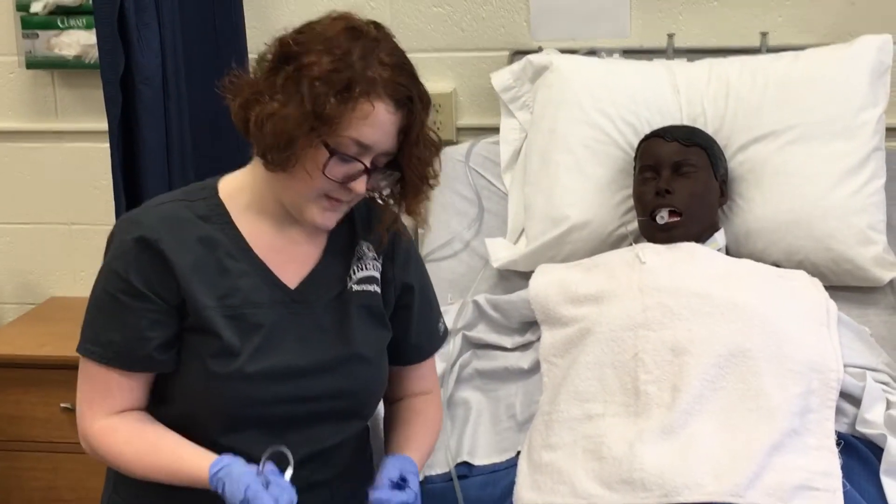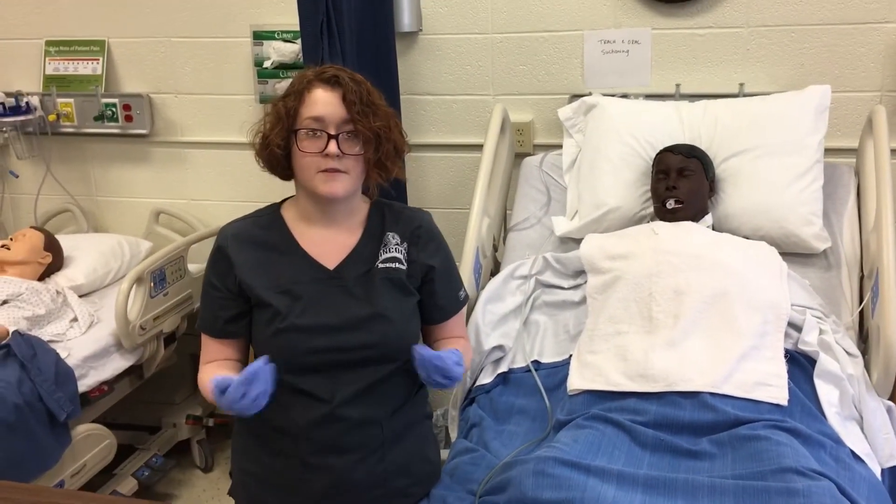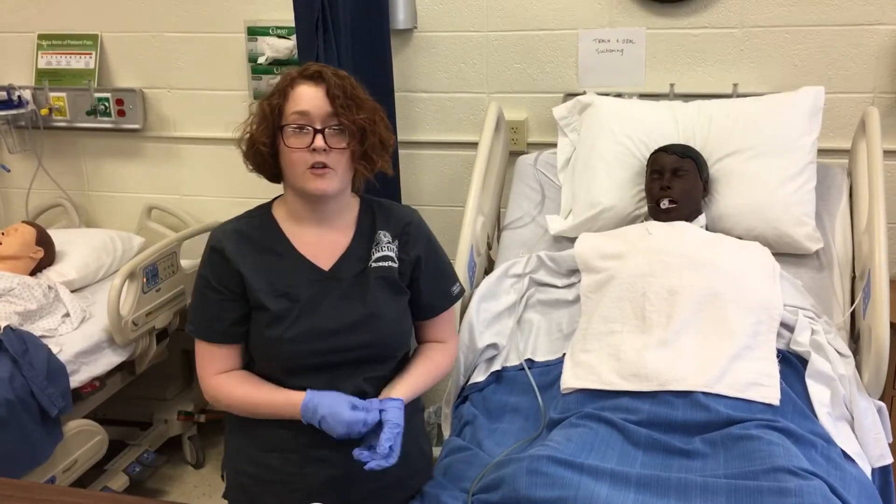After that's completed, I would remove it, throw away the catheter, remove my gloves, perform hand hygiene, assess the patient throughout the procedure, and document all relevant data.